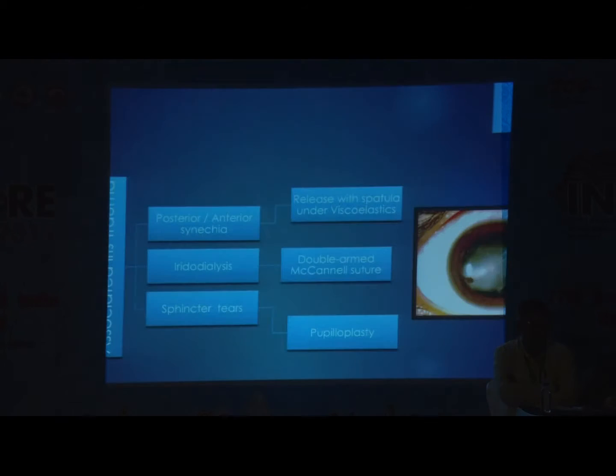So where do we place the IOL? If the capsular bag is intact, placement of a single-piece IOL in the bag is the best. When there's no capsular bag but there is capsular support, in the sulcus, a 3-piece IOL can be placed. And with no capsular support, an SF IOL or glued IOL. Another paper says that the iris-fixated or the scleral-fixated IOL gives similar results, even in long-term pigment dispersion results when compared.